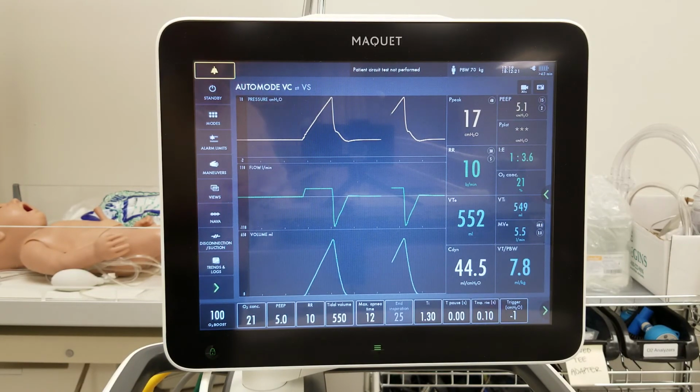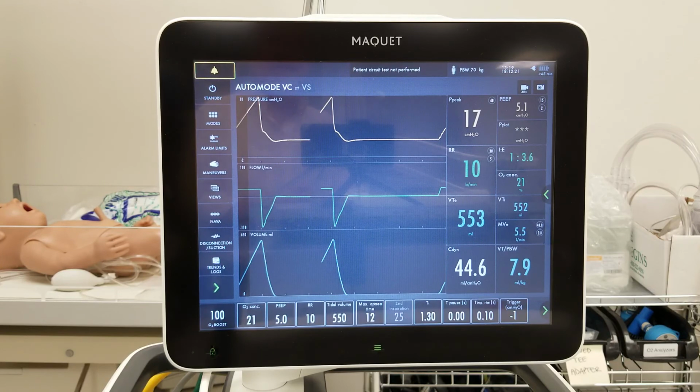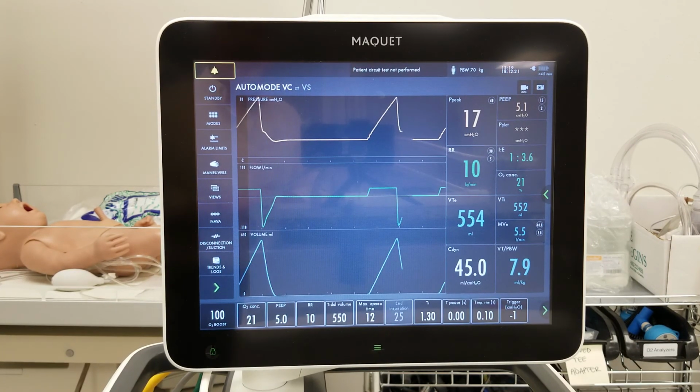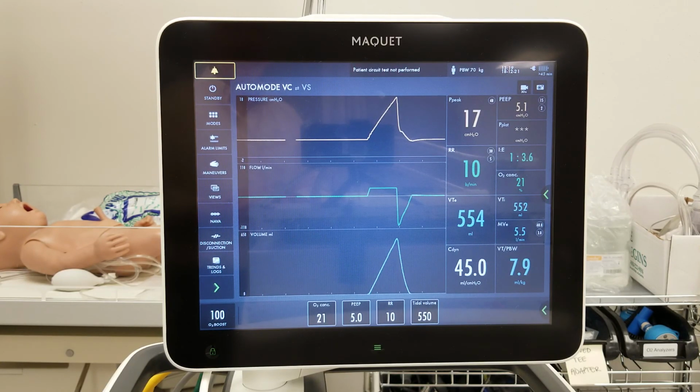I would go into ICUs, and with the sickest patient, I would put them on PC PSV and make sure I play with all the settings to make it adjust to them, and respond best to that patient. Many patients would settle and just do amazingly well on this mode.